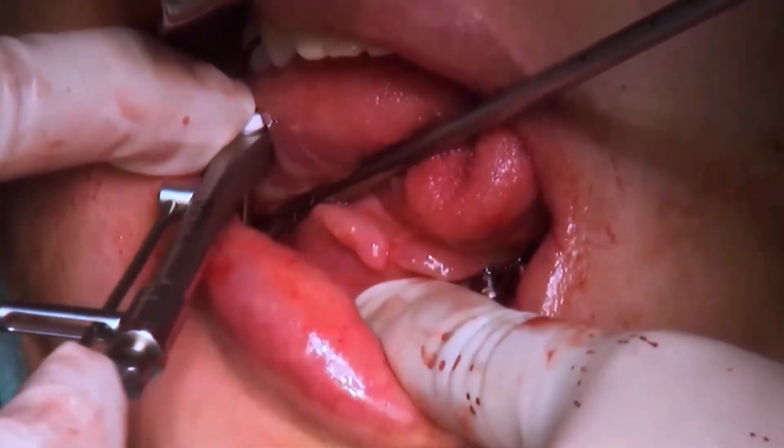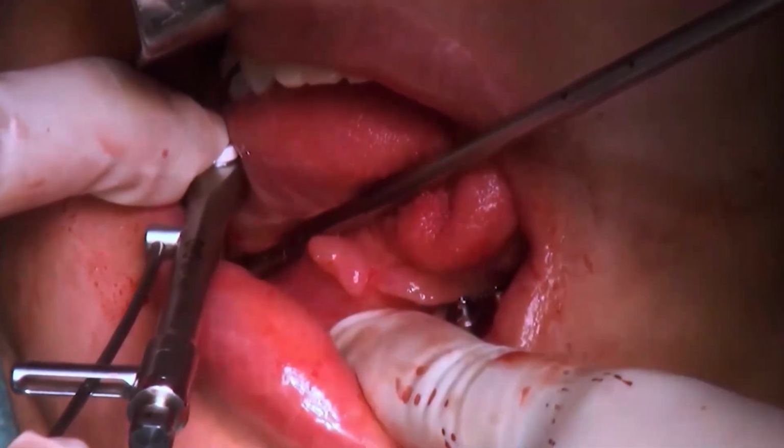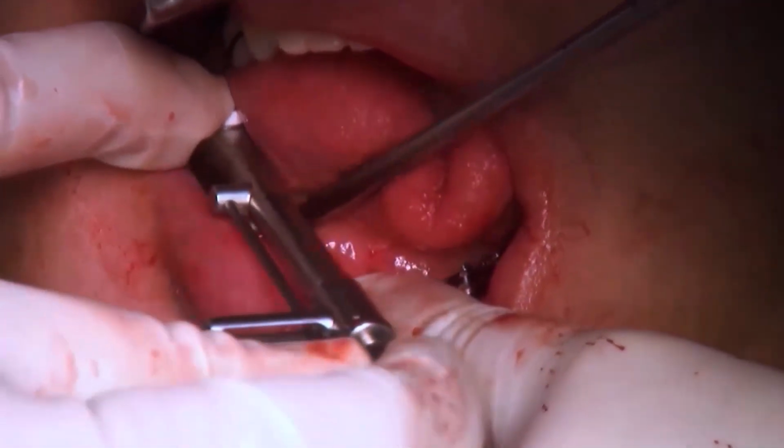The abutments are tightened up to 30 Newton centimeters.